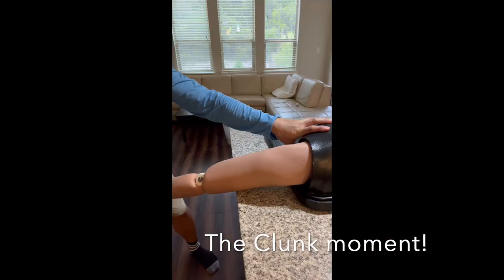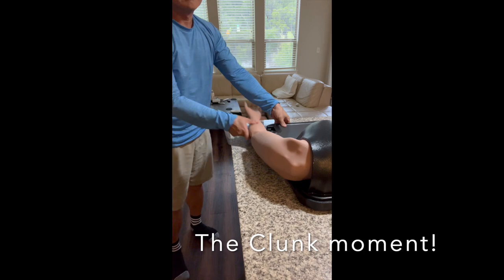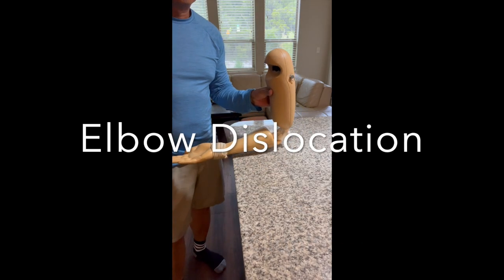Next we have the elbow dislocation simulator. This model teaches you to stabilize the arm and apply the right pressure, step by step.